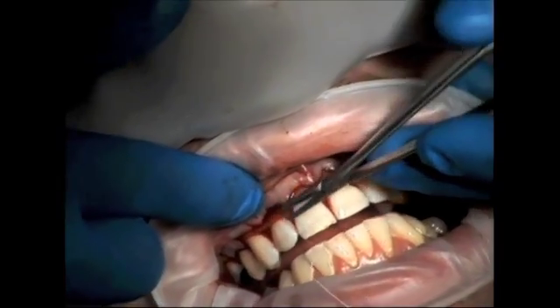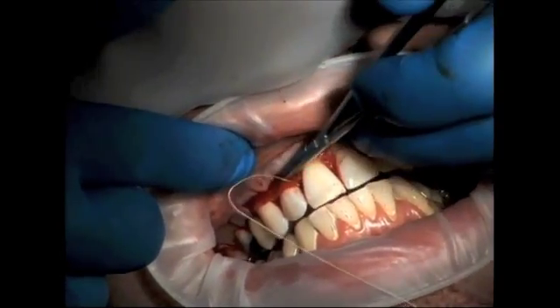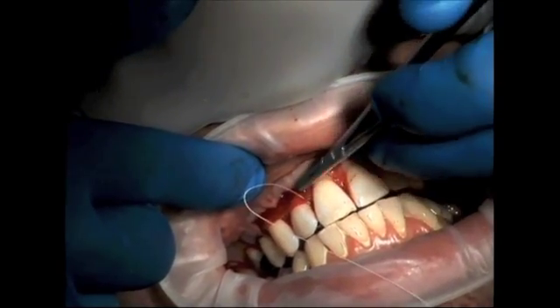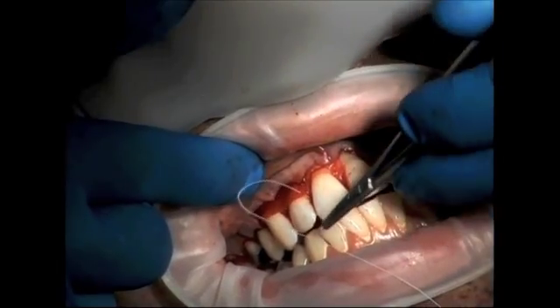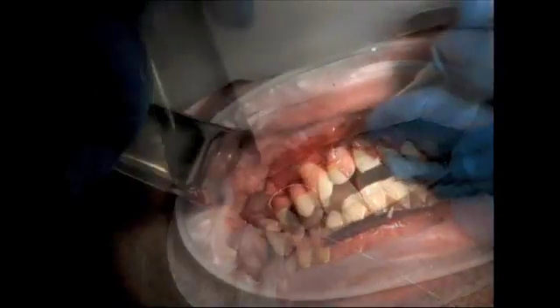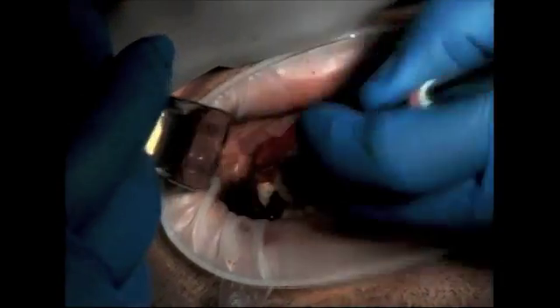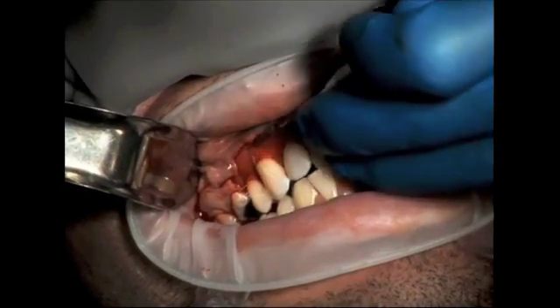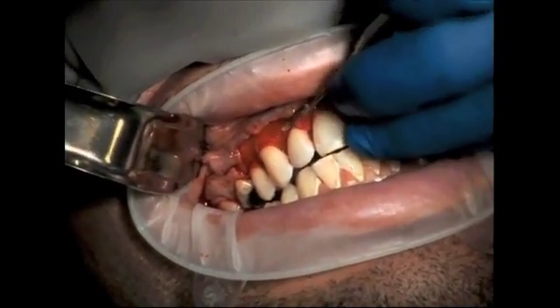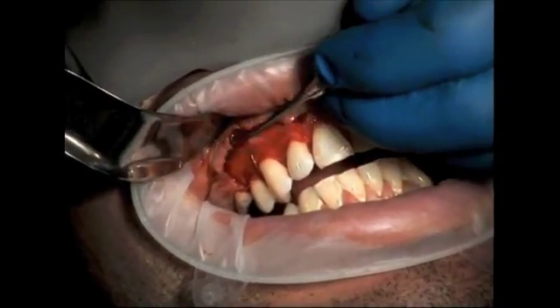Once the graft material is in place, it is now time to suture the material. My favorite suture material for this purpose is 5-0 Vicryl suture, using independent sling sutures. Once the perioderm is secure with the sling sutures, the graft can then be manipulated around the CEJs of the teeth — demonstrated here using the blunt end of a number 1 Woodson. The perioderm is adapted over all recession defects, in this case every tooth from number 4 through 13, with the exception of tooth number 8 which did not have any recession.